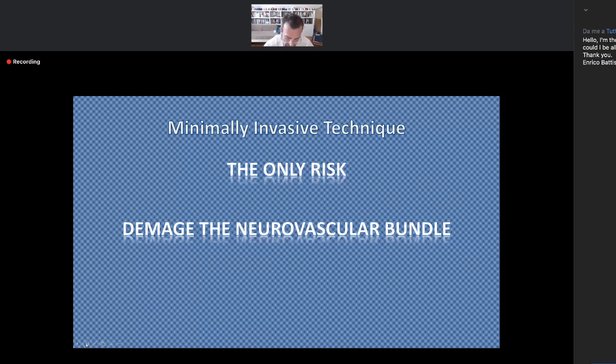And also to be proctored. I think that the first 5, 6 cases, you should be very well taught and very well proctored before you start to do it by yourself, because especially the intraoperative complications could be completely different to the penoscrotal technique. So thank you very much. Thank you.